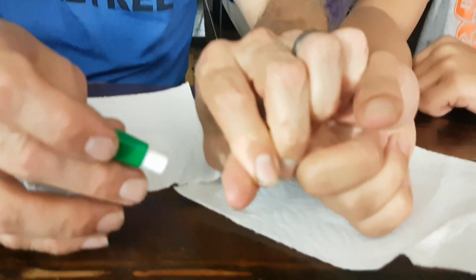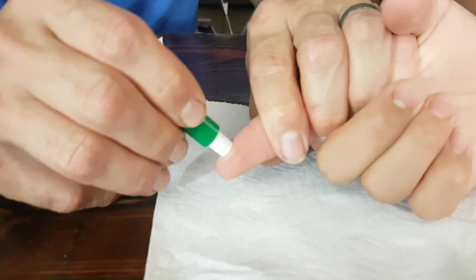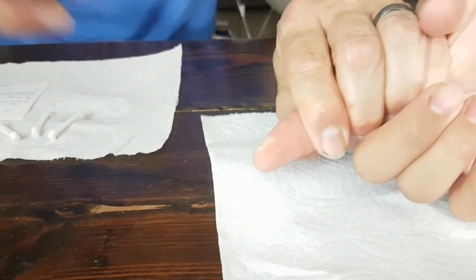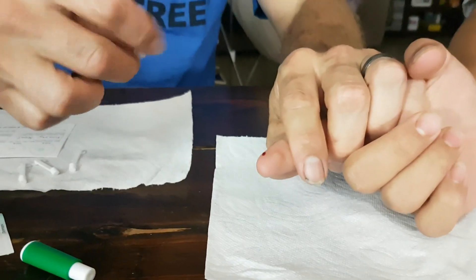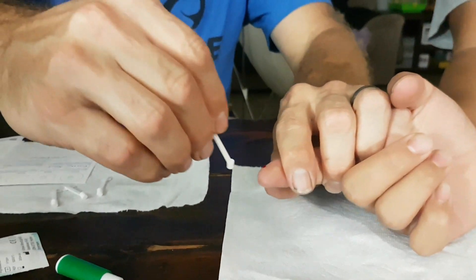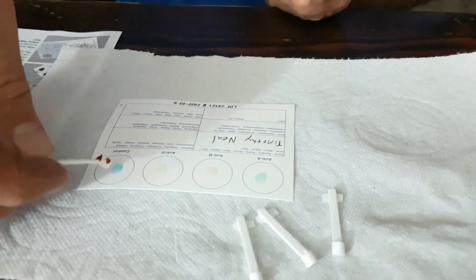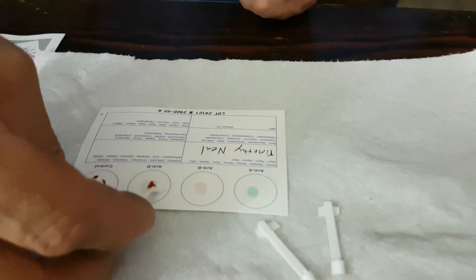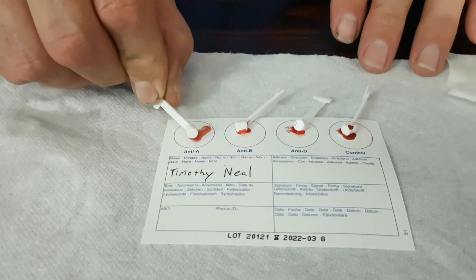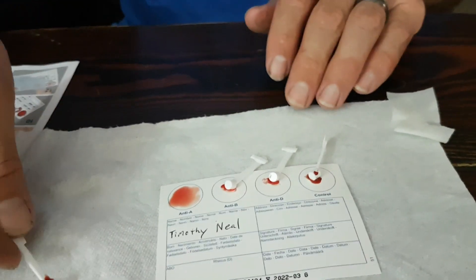All right, here comes the fun part — prepare for a lot of stinging. Come on, you'll be okay. I need a little drop of blood. What we have to do is squeeze enough out to fill this up. You use one little thing, and that's the last one. Timothy's happy.